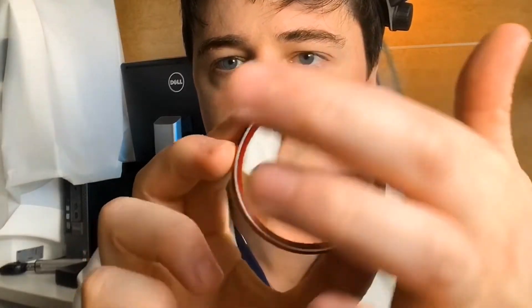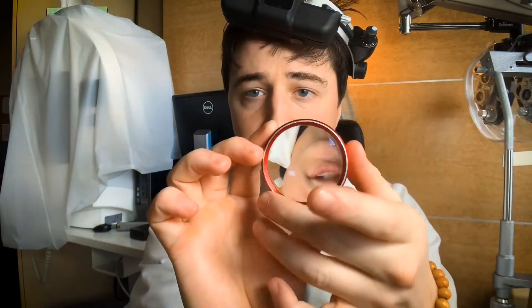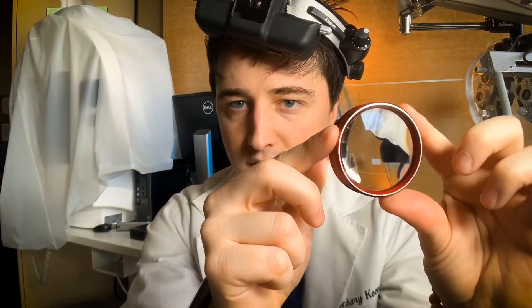Start close, keep it over the pupil — you see the entire eye magnified — then pull back slowly, keeping the pupil in the center, and the retina should come into focus. Another point: you want the silver circle on the lens to be facing the patient. If your lens doesn't have that, normally you want the letters on the side facing down toward the patient. That's how you should hold it.